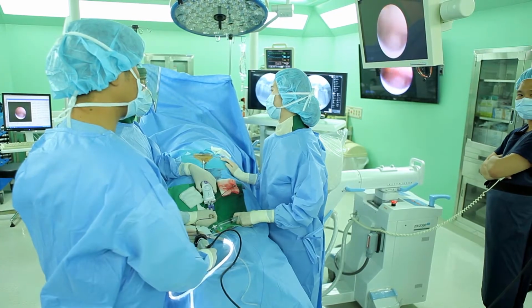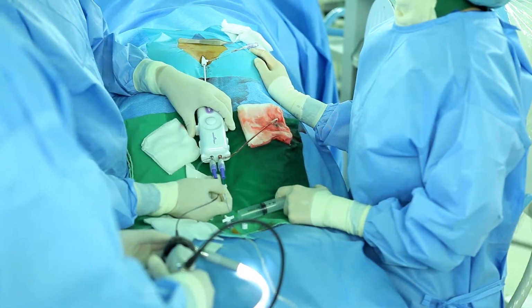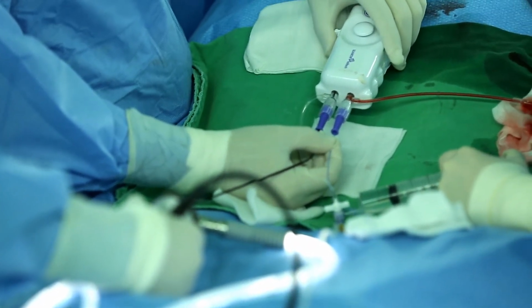You should push 1 to 2 cc saline intermittently, checking for an unclean view because of the bleeding or disc particles, and push 5 cc saline to lyse adhesion for catheter advancement.